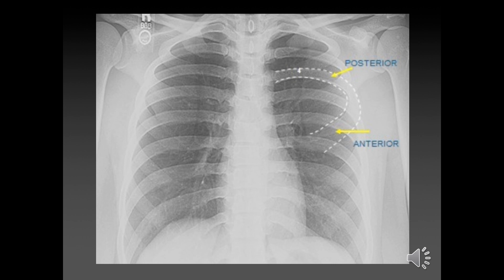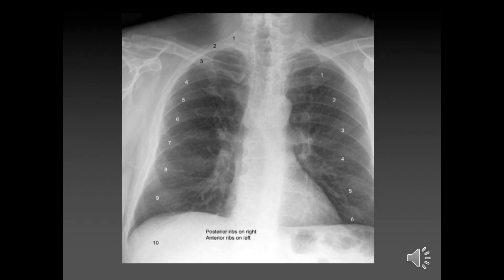Anterior ribs are a little harder to see, and in conditions where bone density isn't quite as good — such as osteopenia or osteoporosis — they're even harder to see. This film of a patient with osteoporosis illustrates exactly that: you can see the posterior ribs, but the anterior ribs are barely visible; you can just about make out the first one.